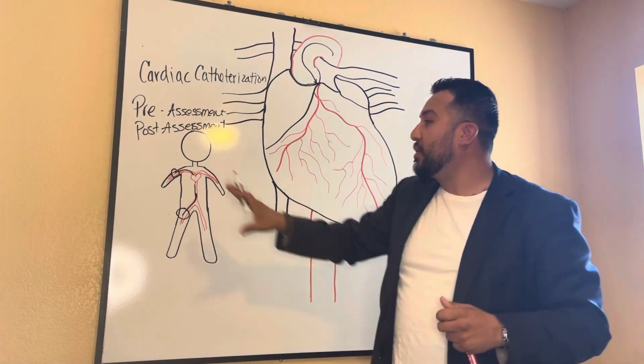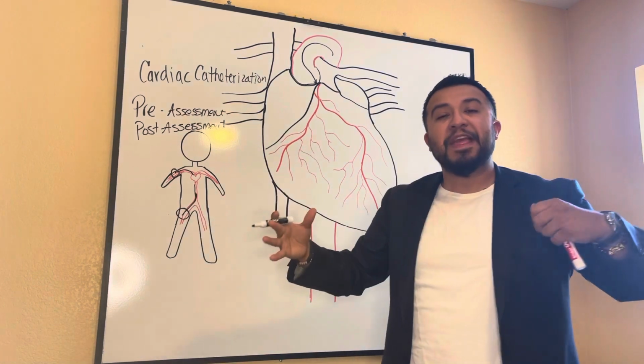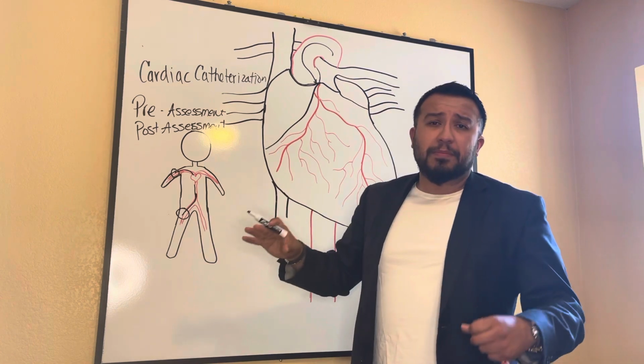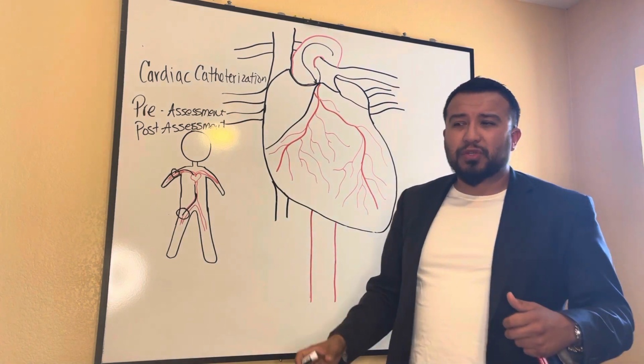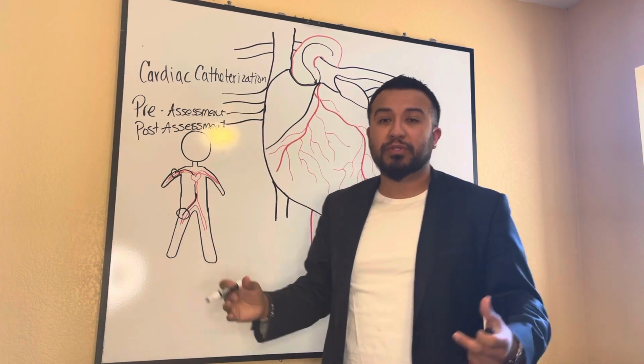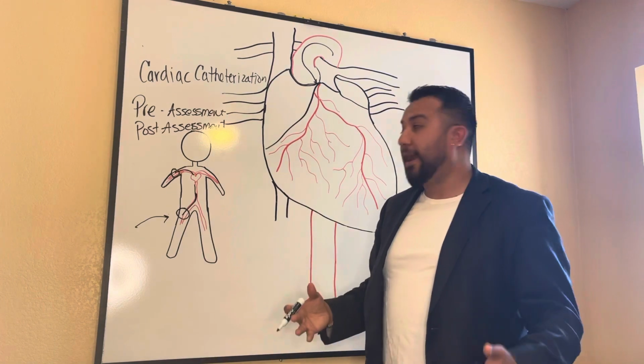We try to not utilize the upper extremity, the brachial artery, because there's more practical use for the upper extremities than there is for the lower extremities. And after your procedure, you're going to be ensuring that the patient keeps their legs straight. So you want to not immobilize the extremity that's for more practical use. So we like to use the femoral artery more when we can.